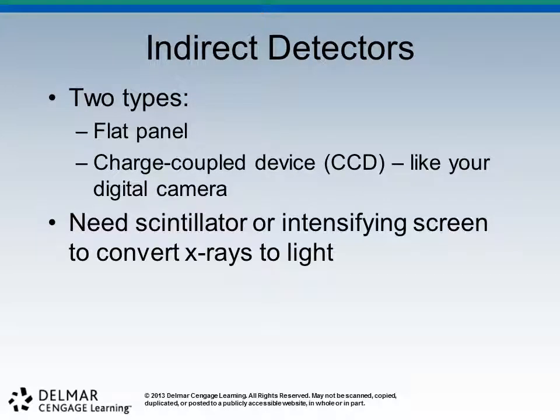We've got a CCD. This is what you carry around on yourself in your digital camera or your cell phone. And we've got the flat panel. The CCDs, as I said the other day, are just huge as far as those are concerned. Not like in your camera. And 75, 100,000, 150,000, I don't know. A lot of money. So don't bang that stuff around, don't break it.